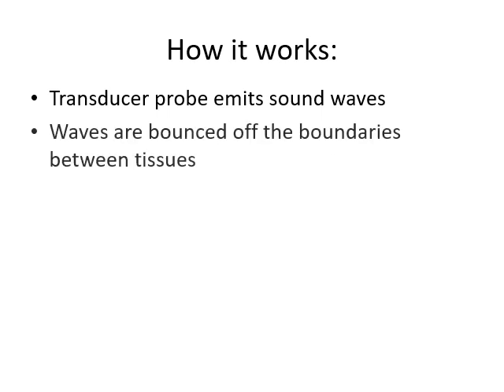Okay, now you should have it on your handout. You have a picture that comes up and it's showing a little bit of that information. So basically, the sound waves are going to go through the medium. So through fat, through skin, it doesn't really go through bone very well. It bounces back really quickly off a bone, and goes straight through fluids. But the waves are going to bounce off the boundaries between the tissues. So if you were doing an ultrasound of the bladder, the sound waves would travel through the liquid in your bladder, bounce off the back side of the bladder, and then come back out to the transducer.